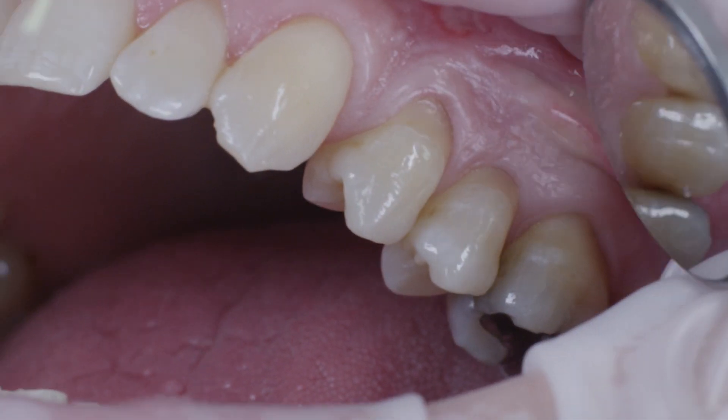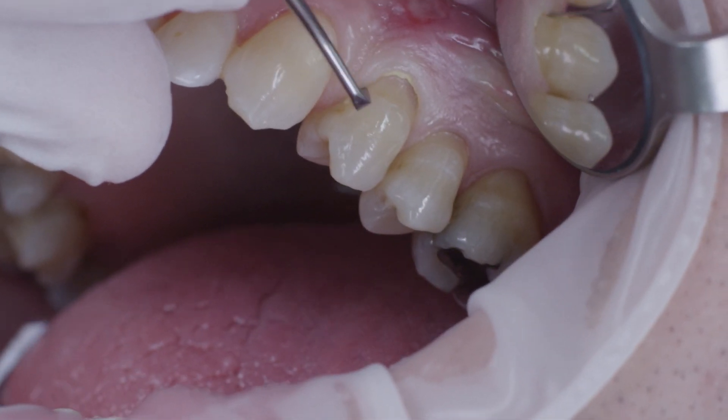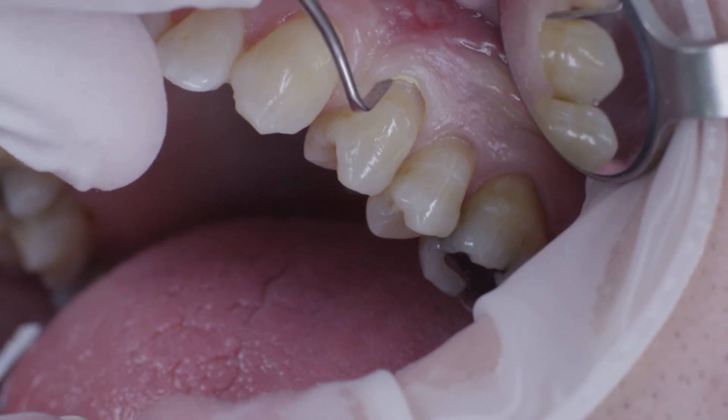A middle-aged patient, the managing director of a marketing company in Frankfurt, came to my practice because he was bothered by the class 5 defects on tooth 2-4 and 2-5. To expose the preparation margins, a cord size 0 was placed in the sulcus.